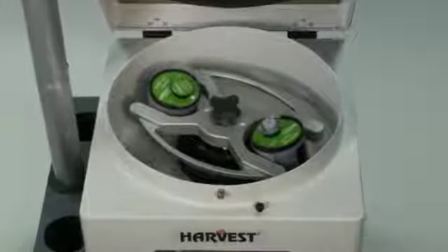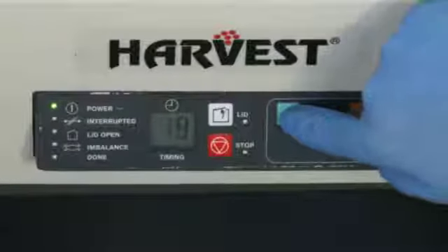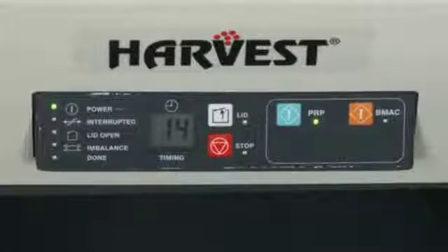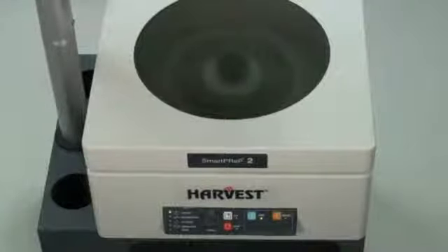Close the centrifuge lid and start the centrifuge cycle. For SmartPrep 2 systems with serial numbers 101 to 5999, press the green Start button. For SmartPrep 2 systems with serial numbers 6000 and above, press the blue PRP button. The approximate centrifuge runtime is 4 minutes. While the minimum centrifuge time is 4 minutes, the AdiPrep disposable may be processed through the entire 14-minute centrifugation cycle with no negative impact on the adipose tissue sample.